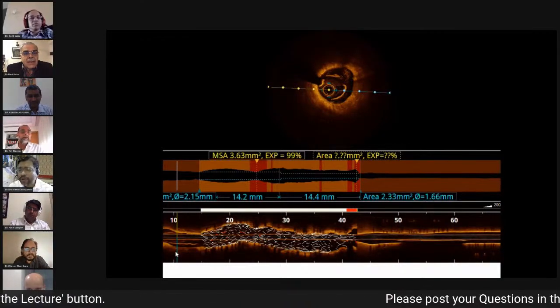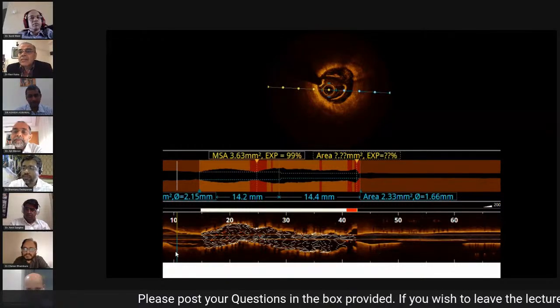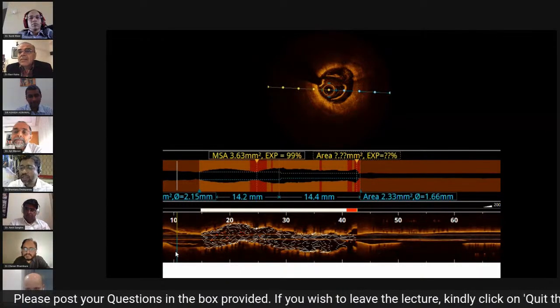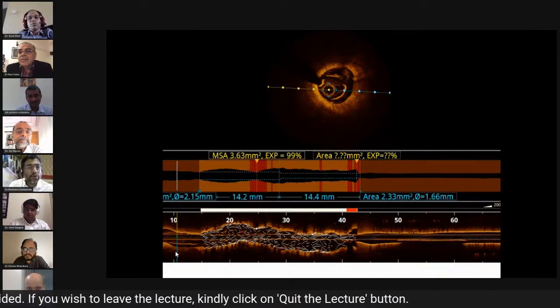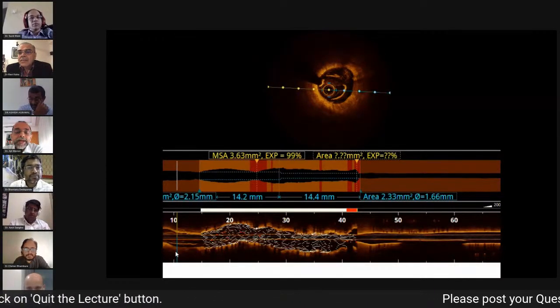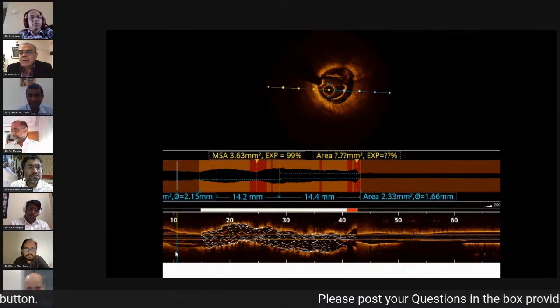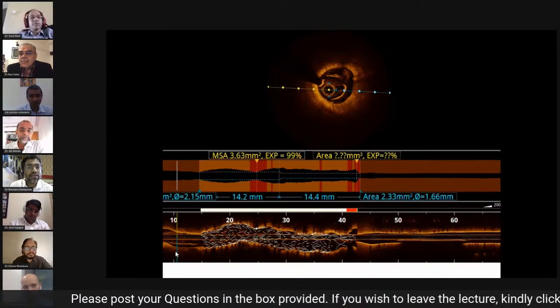There is a comment from the viewers that sometimes you may have to use an ultra high pressure balloon like OPN to dilate the lesion. What they are saying is you can combine IVL with OPN. Any experience about that? Right, and in calcific spurs which are eccentric, whether it is really advisable, that is what we actually wanted to know.